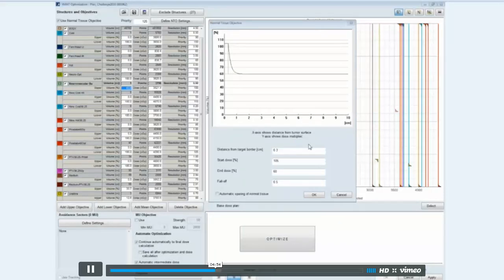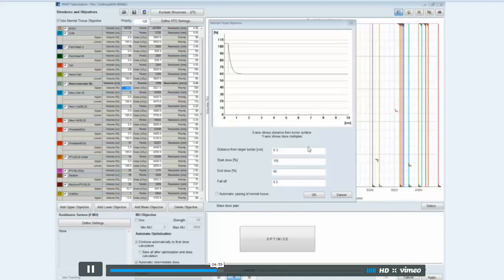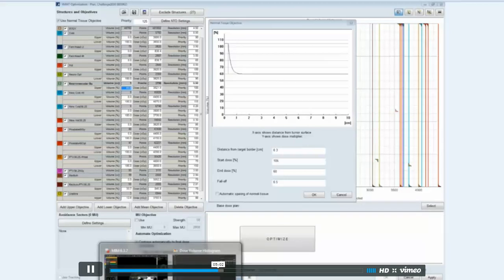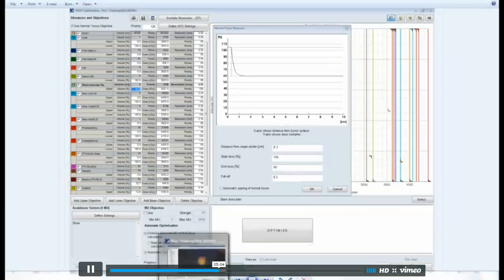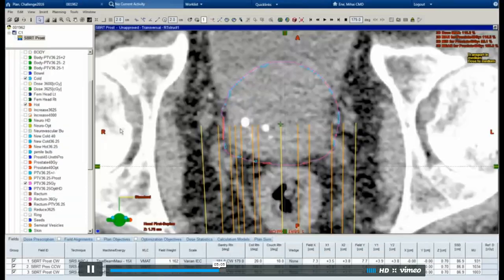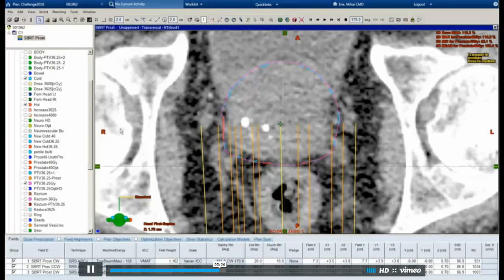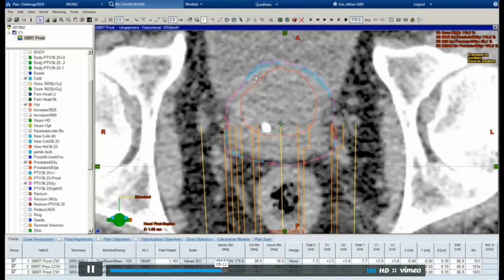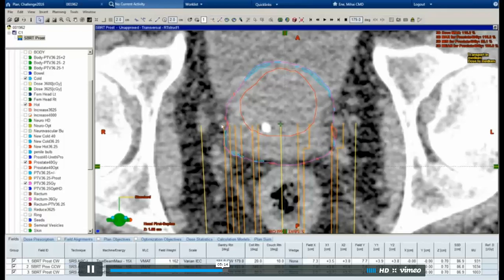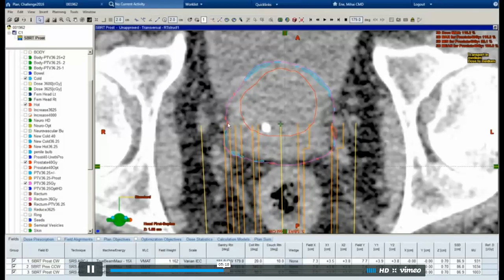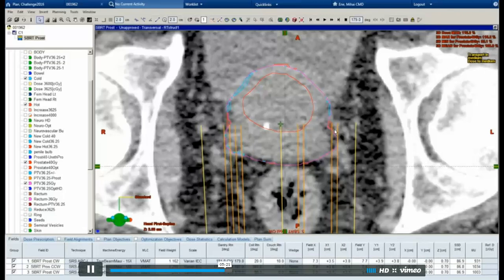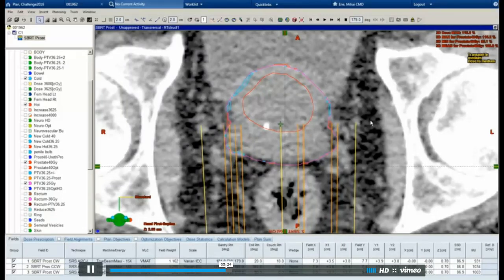What did you do to get your score better? What changes did you make? I changed my NTO settings, created hot and cold structures. I looked at my coverage, so I took my prescription dose and converted it into a structure. I saw where I had cold spots that needed filling, what I call hot spots, or places where prescription dose spilled over the PTV margins. I drew those out and placed constraints on them in the following optimization.